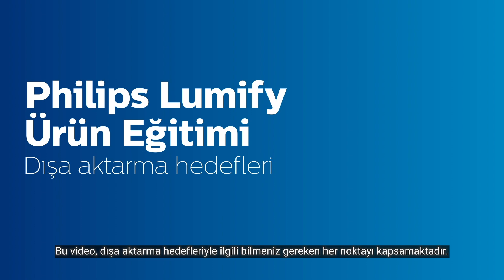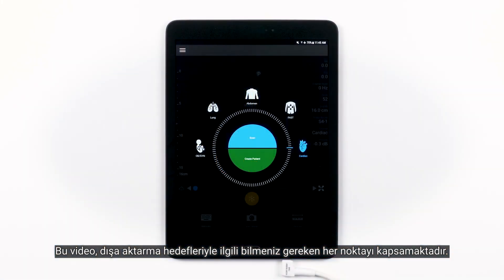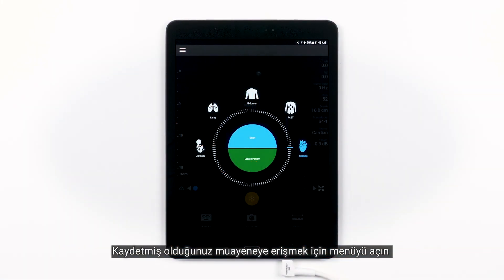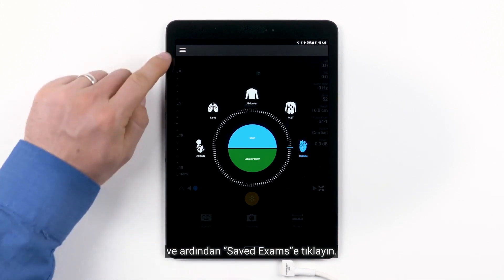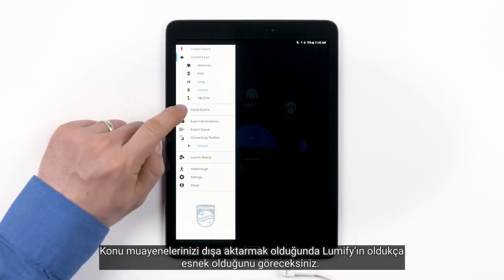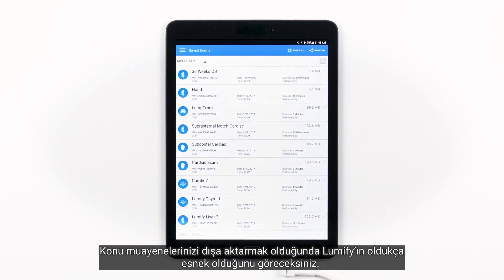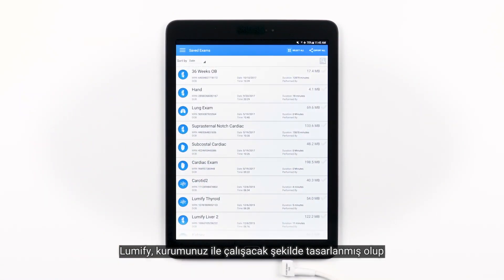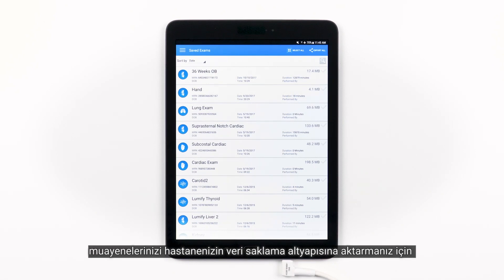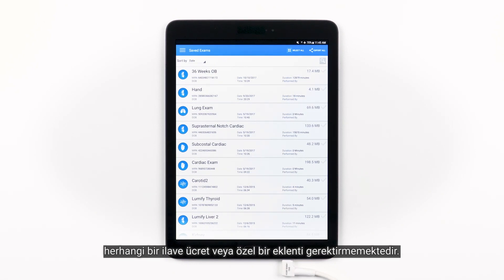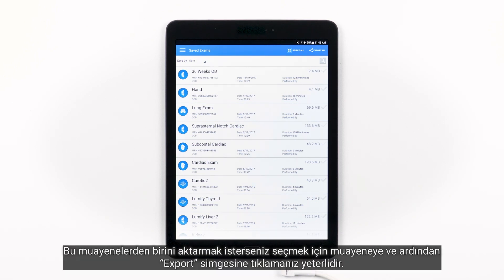This video is going to cover everything you need to know about export destinations. To access a previously saved exam, open the menu and then tap Saved Exams. You will find that Lumify is extremely flexible when it comes to exporting your exams. Lumify was designed to work with your institution and doesn't require any additional fees or proprietary plugins in order for you to export your exams to your hospital storage infrastructure.